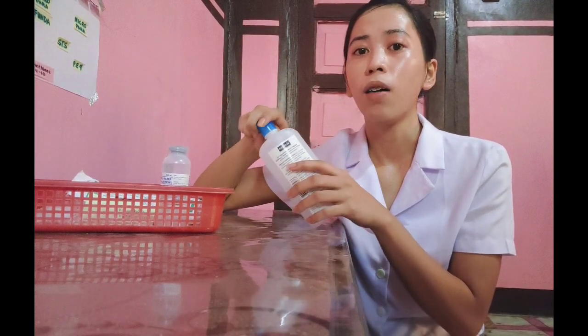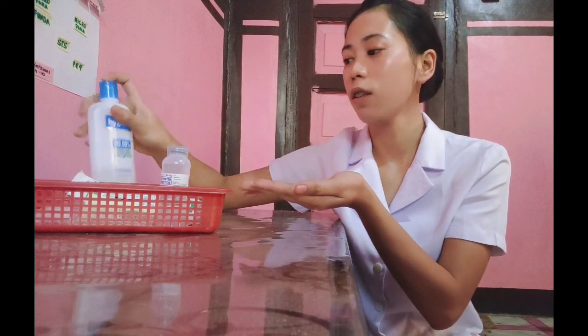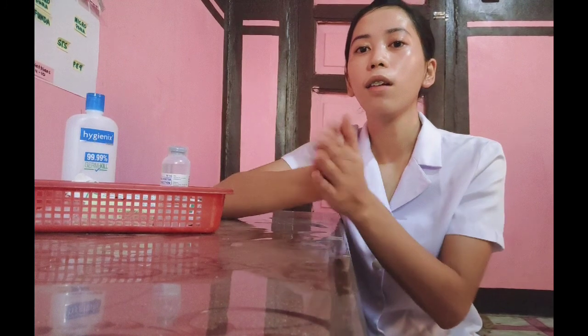And then we will now perform hand hygiene and observe other appropriate infection prevention procedures. And then prepare the medication vial for reconstitution. The rationale is preparation that has changed in appearance should be discarded.